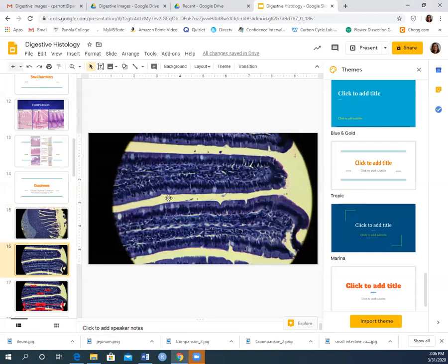Okay, so this is the duodenum, and now we're going to go to another one because it's a little bit more magnified here. So each one of these large fingers here is a plica circularis. And what you'll see on the plica circularis of the duodenum as well is you have these goblet cells, or these mucus cells. And you can see they're very, very distinct. You see those that I just circled in red? So again, you'll need to know that those big fingers are your plica circularis.